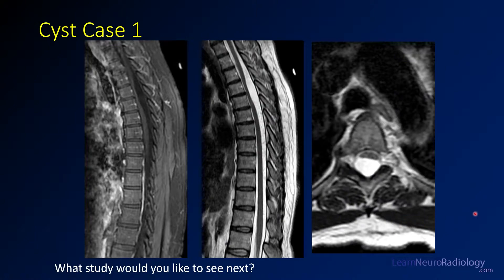This is cyst case number one. We have images from an MRI of the thoracic spine. On the post-contrast with fat saturation, you see a little bit of deflection of the thoracic spinal cord, confirmed on the sagittal T2. You see the normal contour of the cord deflected anteriorly, with something that looks perhaps a little bit rounded. On the axial images, you see a rounded lesion in that location, with the spinal cord deflected anteriorly. We need to consider what additional study might help better evaluate this lesion.